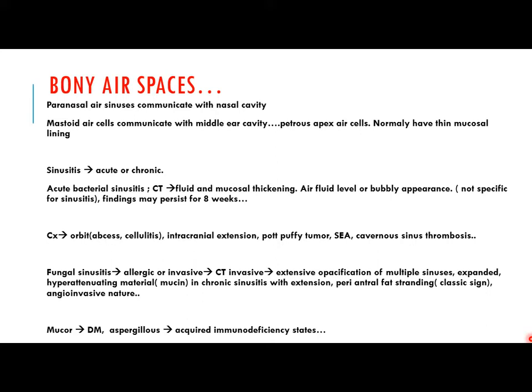Sinusitis may be acute or chronic, and in acute cases we may have a bacterial sinusitis which makes a fluid level and mucosal thickening, air-fluid level or bubbly appearance. This is a finding which we see mostly in the CT department. We see the bubbly appearance in the sinuses, mostly going with acute bacterial sinusitis.